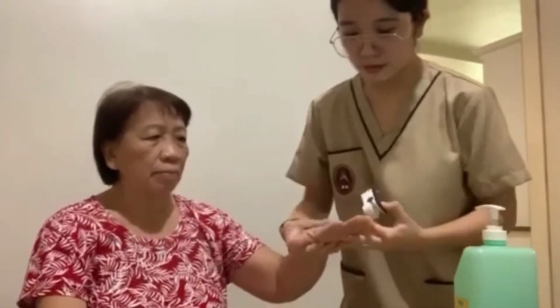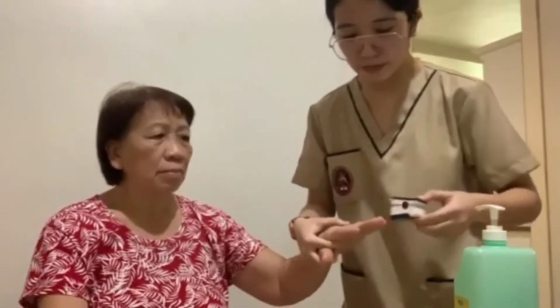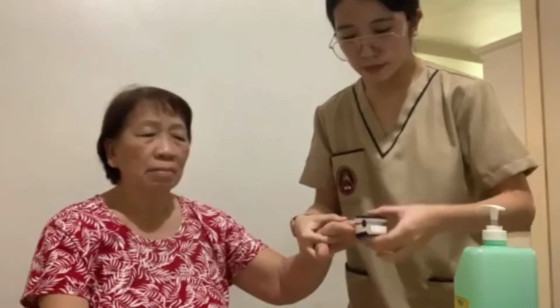We also need to perform hand hygiene and observe appropriate infection prevention procedures. We also provide for client privacy. We also choose a sensor that is appropriate for the client's size and desired location. A pediatric sensor could be used for a small adult. If our client is allergic to adhesive, we use a clip or sensor without adhesive.